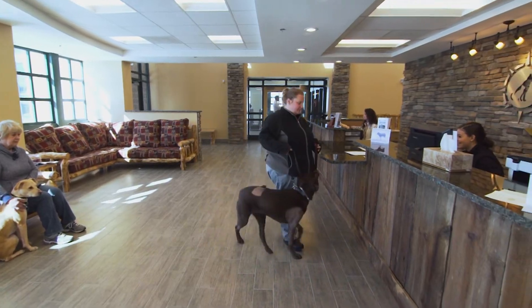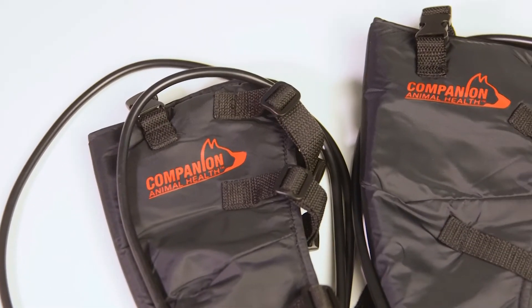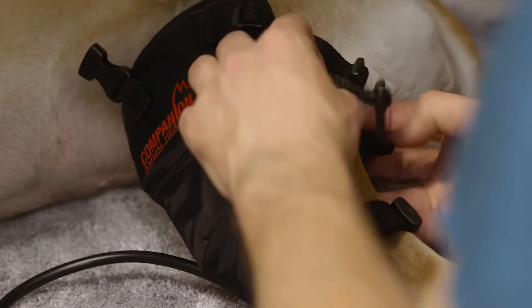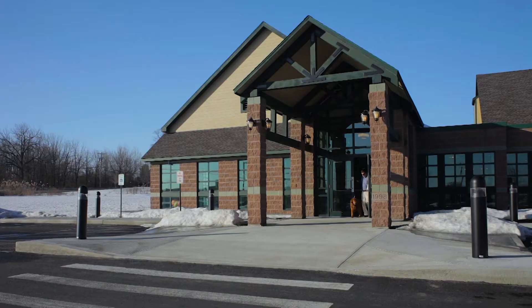Following a surgical procedure, we'll use the companion system before the patient's even extubated. We can use it for cruciate surgeries of any types. We may use it just for meniscal injuries following surgery. Our patella luxation corrections also benefit from it. We'll have that on for about 20 minutes to start minimizing the swelling before it even occurs, then repeat that every four to six hours until the patient is discharged the following day.